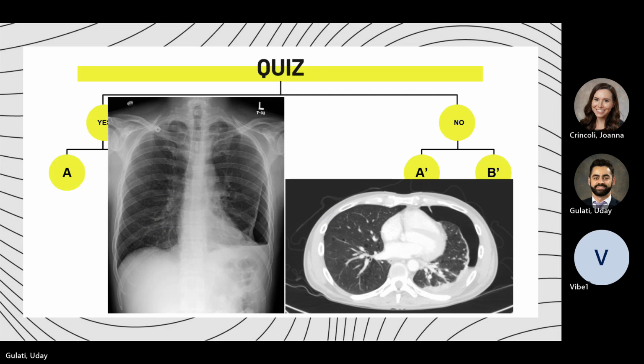If this was a pneumothorax and you saw a lung point here, remember the difference between lung point and lung pulse. If you put on that M mode and you saw it going in and out, you can slow this down, take a video, or put M mode and keep it at that point. You see that in a certain region you're seeing lung sliding, and then that same region, the same area where you had the M mode, is now haziness. That's your lung point, and that is a pneumothorax. So it's very important to differentiate between a lung point and a lung pulse.